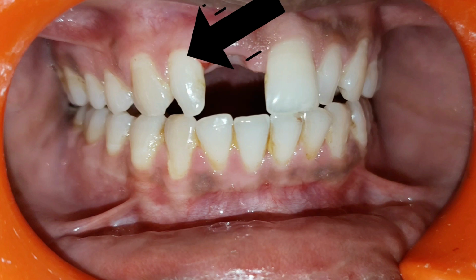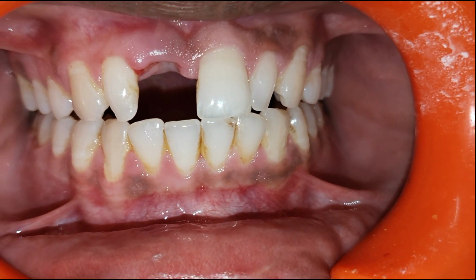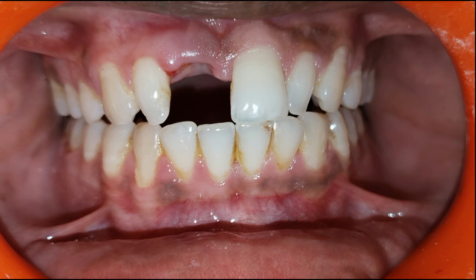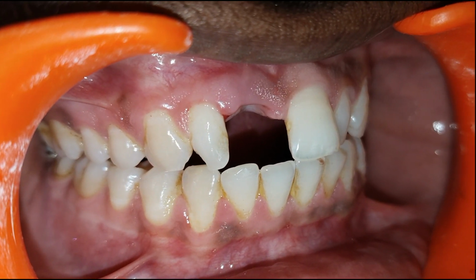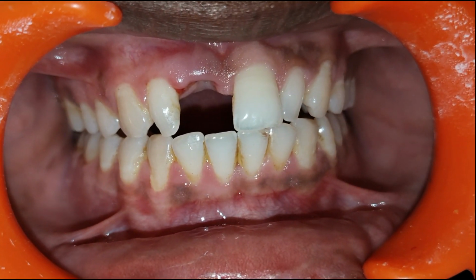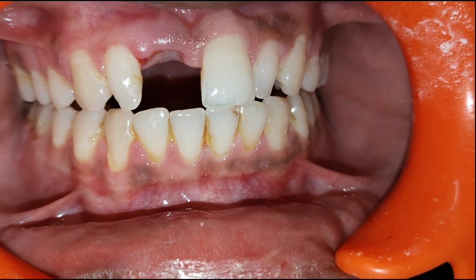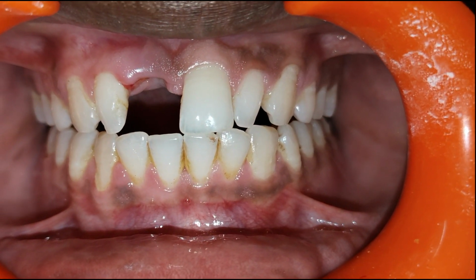So we have a case. As we all know, the anterior maxillary region in the mouth has been of major aesthetic concern for dentists and for the patient. So we have to know how to choose an implant and how to place an implant and the correct angulation, because maxillary anteriors are at an angulation. So we have to follow that angulation to maintain the aesthetic and the smile of the patient. Treatment planning is very essential in case of maxillary anterior.